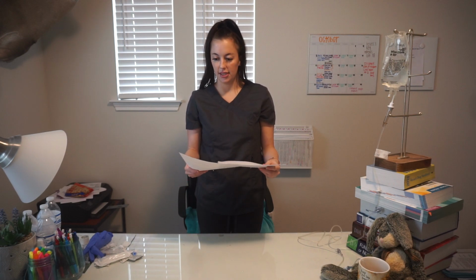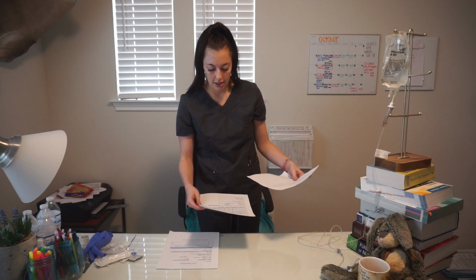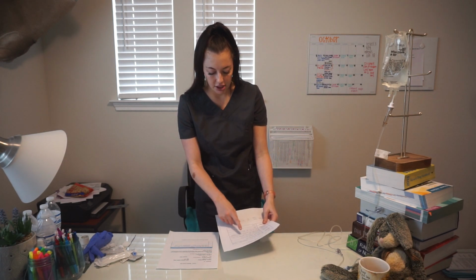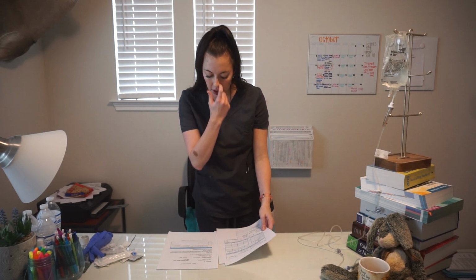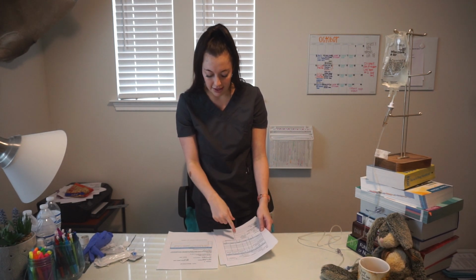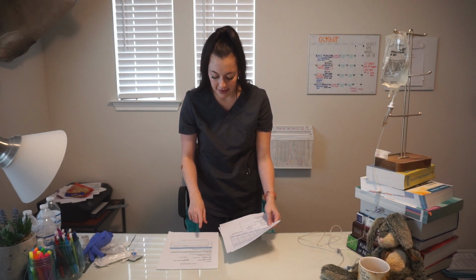Now I'm going to document my 8 rights, which is I have my right patient, my right medication, my right dose, right time, right route, right reason, right response, and right documentation. Okay.